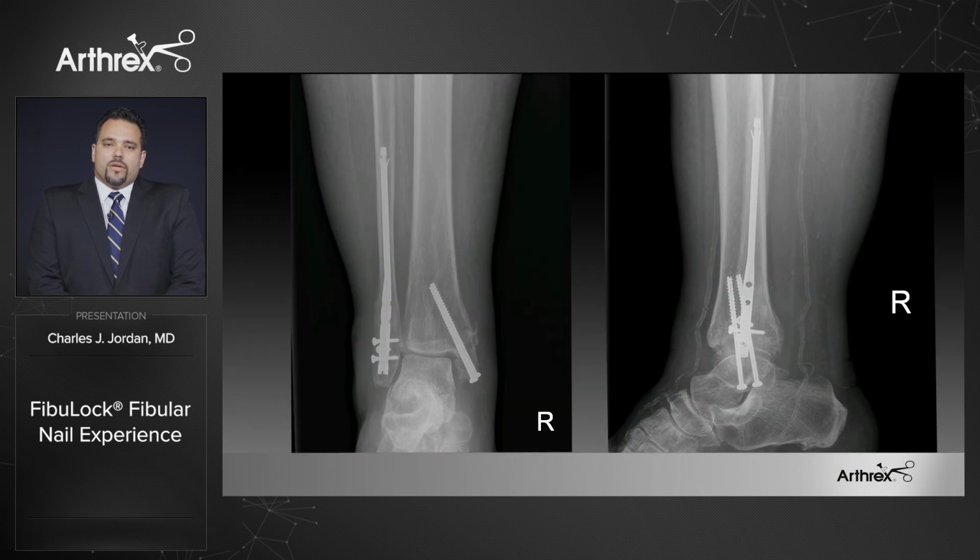Her ankle was stable, and we made the decision, because of her need for early mobilization, to make her weight bearing as tolerated from postoperative day number 1. She was placed in a cam walker boot, she received physical therapy, and she began to take steps out of bed to a chair on postoperative day number 1. She was able to mobilize quickly.